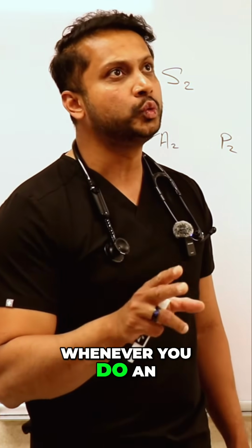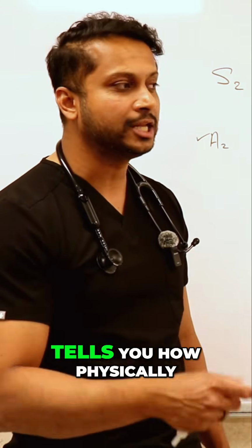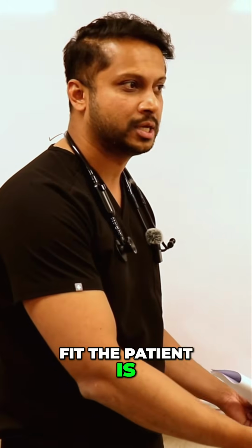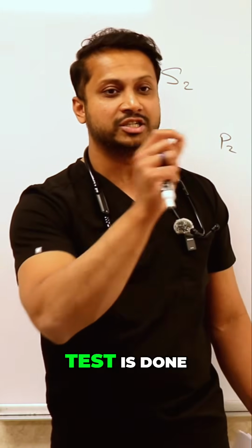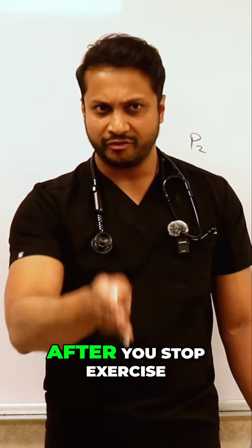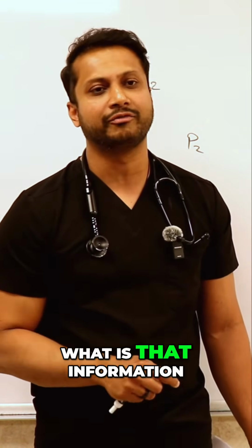Now, whenever you do an exercise EKG, why is it so good that you do actual physical exercise? Why is it important? It tells you how physically fit the patient is. What's the patient's cardiac health? Another important thing, the moment your stress test is done, the next 1 minute after you stop exercise, is that going to tell you some important information? Yes, it is. What is that information?